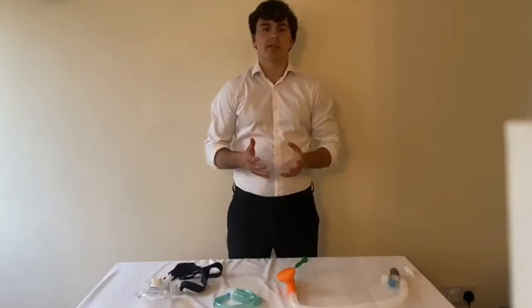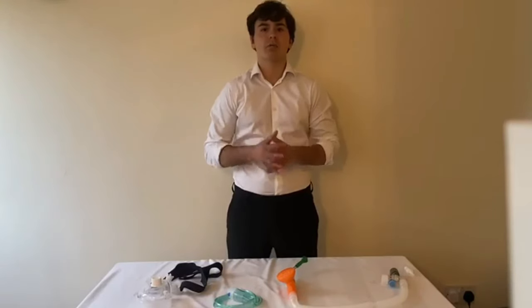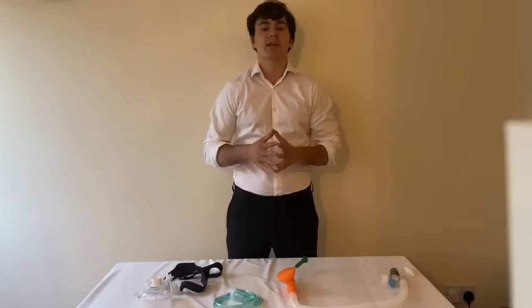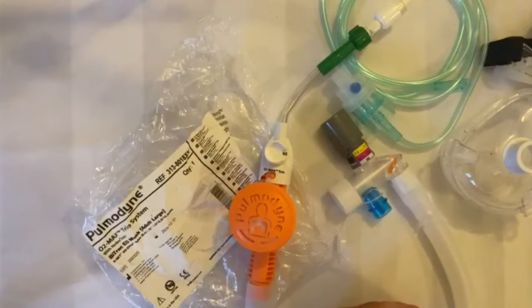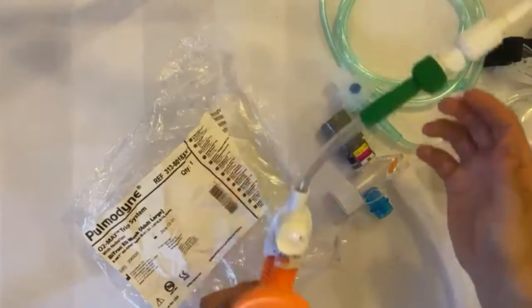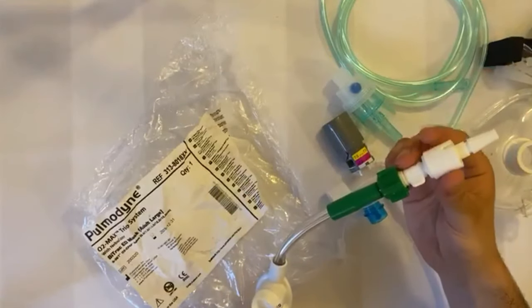To begin setting up the kit, tear open the bag containing all the components except the white Schrader connector. The Schrader connector will have to be connected to the kit, which is done by screwing the connector onto the rest of the circuit. When all of the components are out of the bag, attach the Schrader connector to the circuit by screwing it into the port.